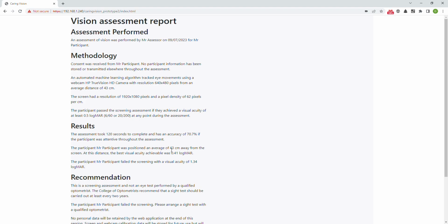I don't have access to a retina display screen. This is a pretty standard, fairly modern laptop, a few years old, and I believe it's 155 dots per inch, the number of pixels per inch. So that's the kind of level of detail I'm able to see on this screen. And as it says, the best vision achievable on this screen is 0.41 logMAR. To give you an idea, 20/20 vision is 0 logMAR. So 0.4 is significantly larger detail than 20/20 vision.